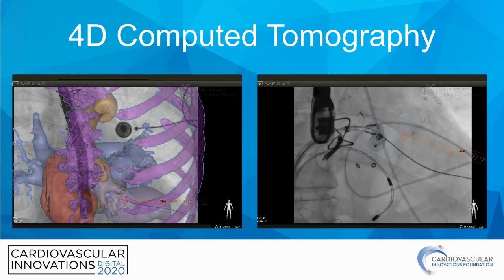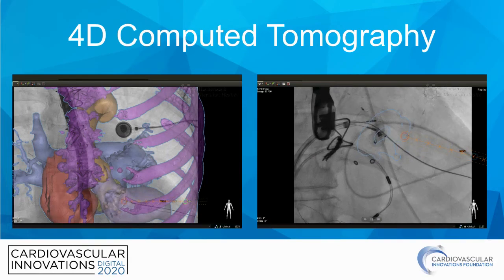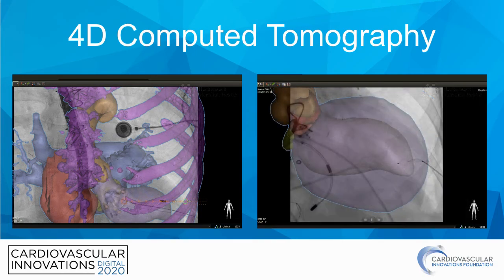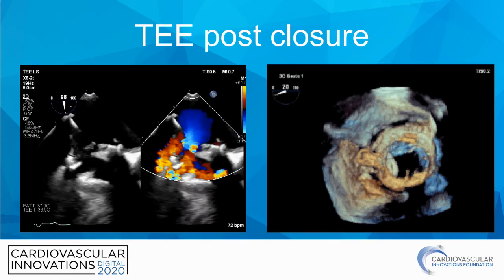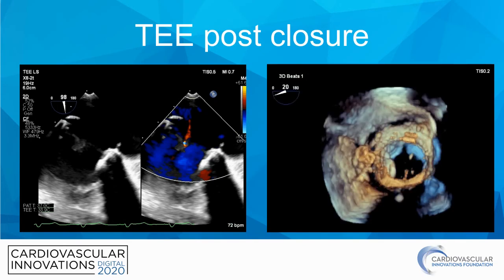Due to persistent leak, an additional 8 mm AVP4 device was advanced and deployed across the PVL. Transapical access was closed using an AVP4 device and Surgiflow hemostatic matrix. Residual PVL was evaluated by 2D and 3D TEE and determined to be trace.